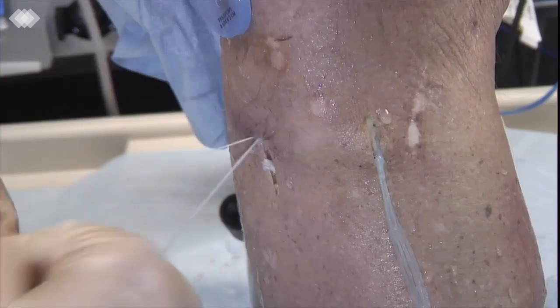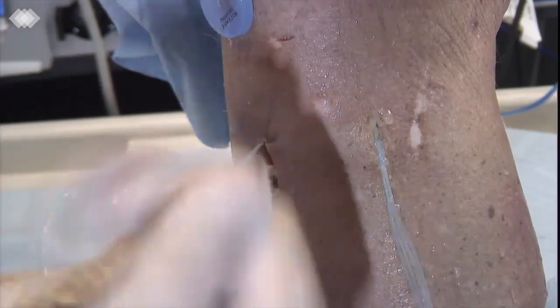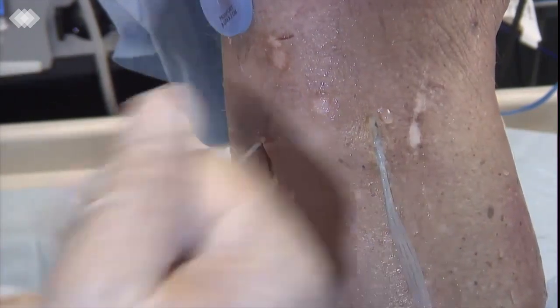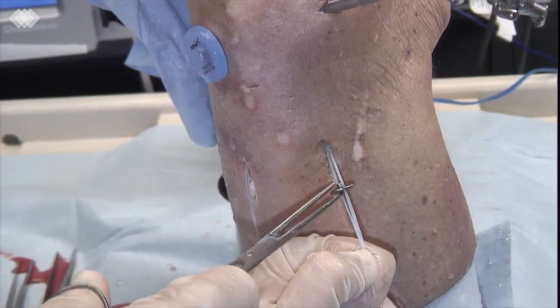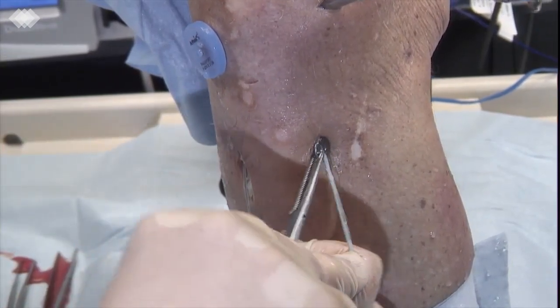Tibial fixation is finally performed with two 11mm concave buttons with 4mm collar tibial fixation devices, after applying the final and desired meniscal tension.